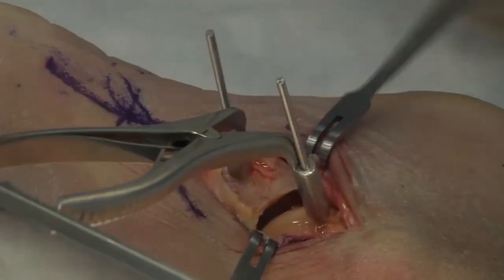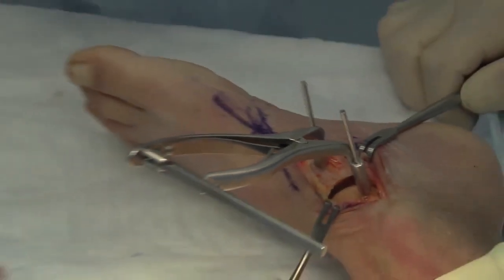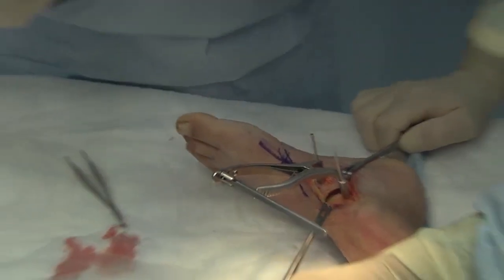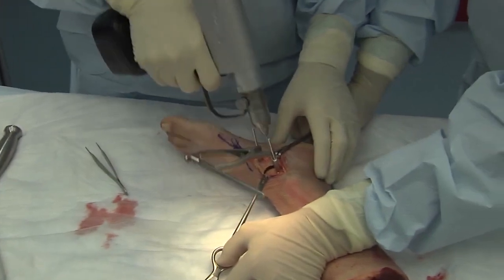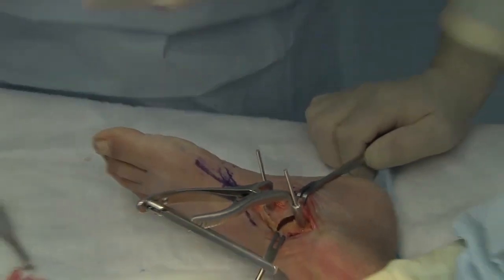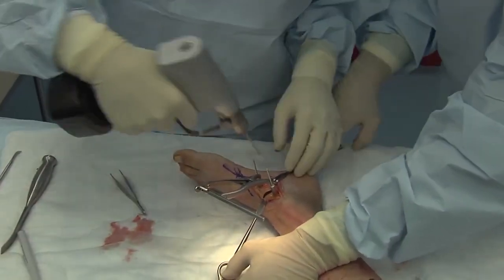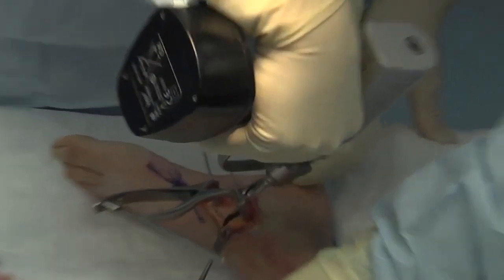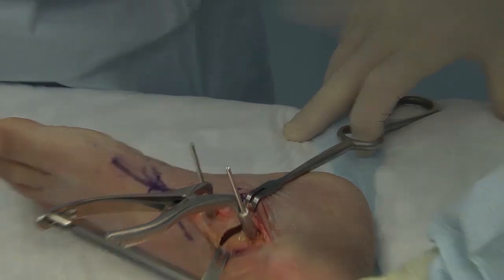Once you get down to subchondral bone and all the cartilage has been removed, we use a small drill — a small K-wire — just to fenestrate the joint in multiple areas. The goal is to try to get through that subchondral bone into the vascular tidemark layer of the subchondral bone, promote some bleeding, and bring in fresh blood supply to what can often be very sclerotic bone.